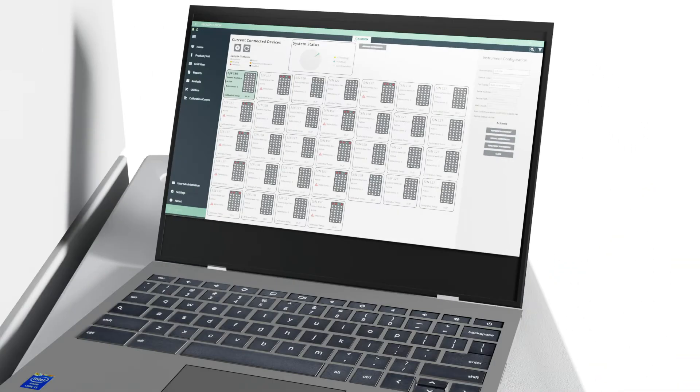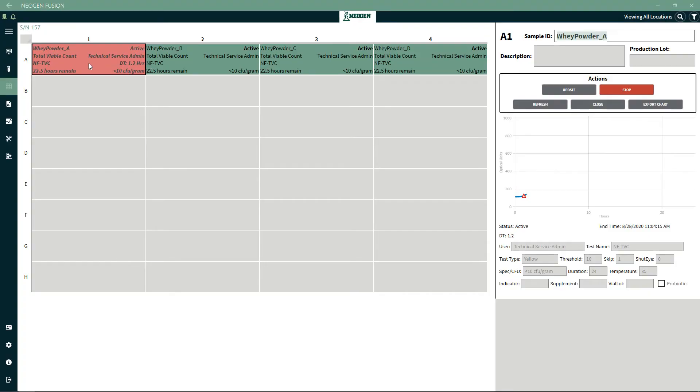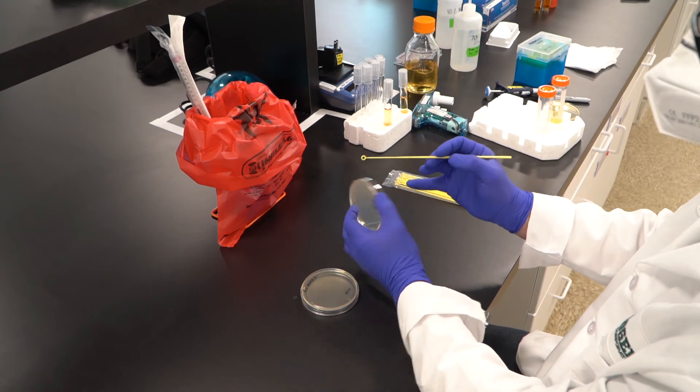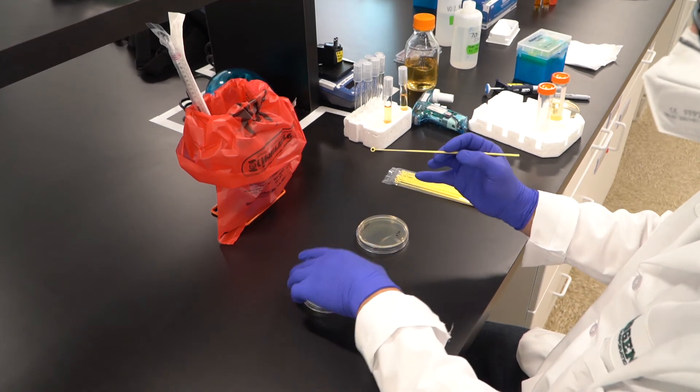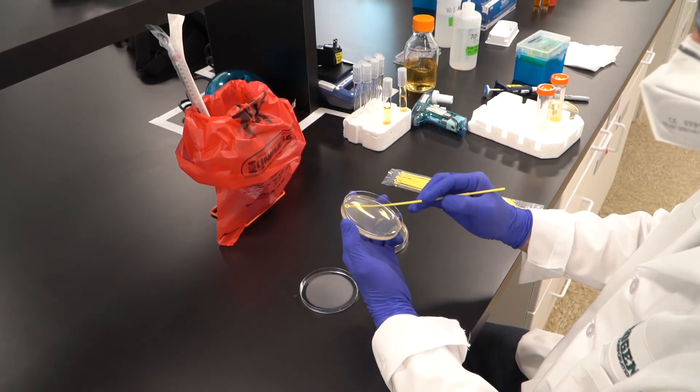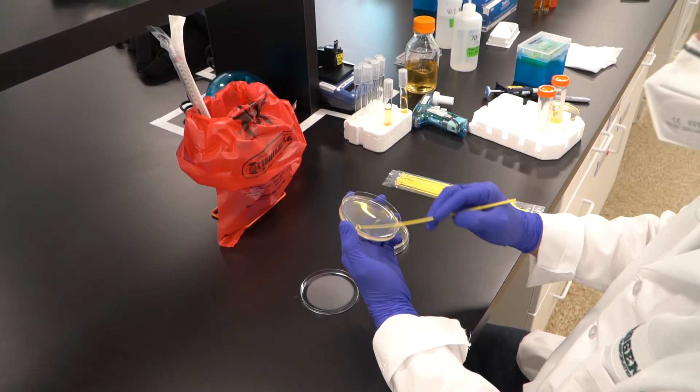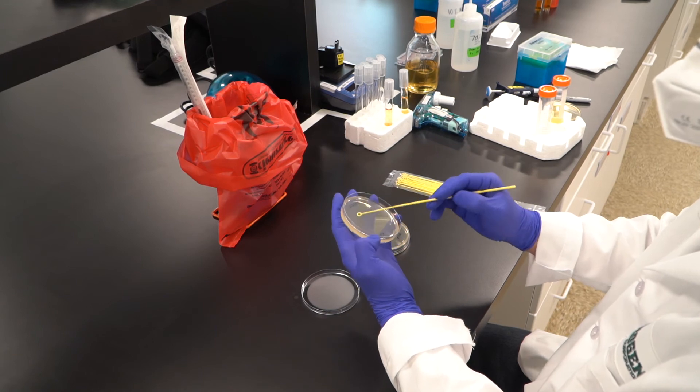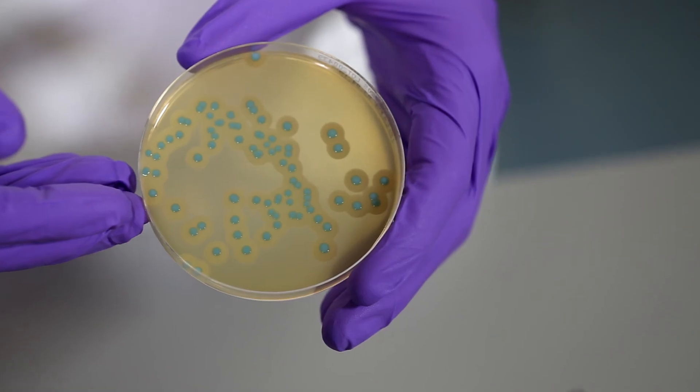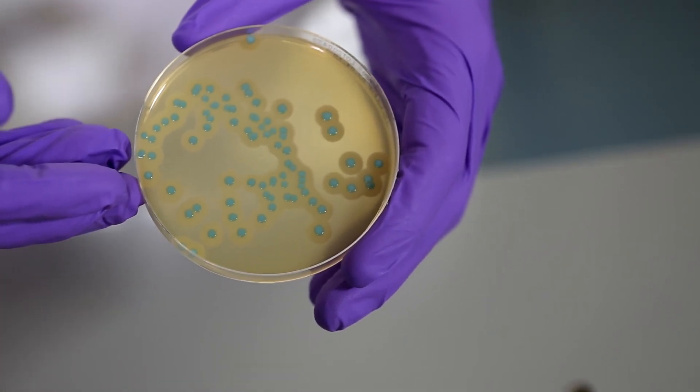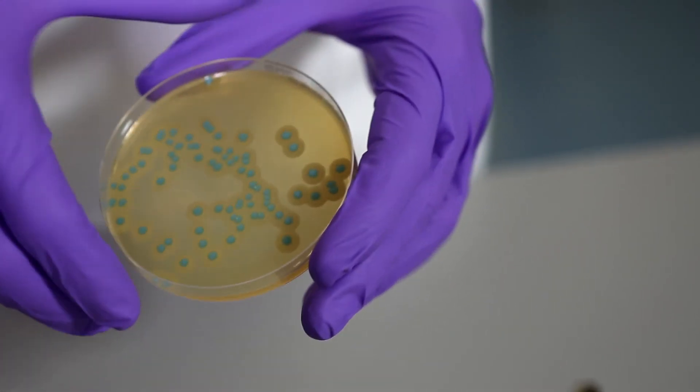The software continuously monitors each sample status as it incubates. This eliminates the need for analysts who are customarily required to inspect and visually count agar plates in traditional microbiology. This in turn eliminates the risk of human error.